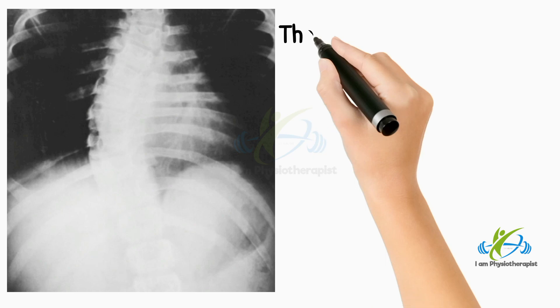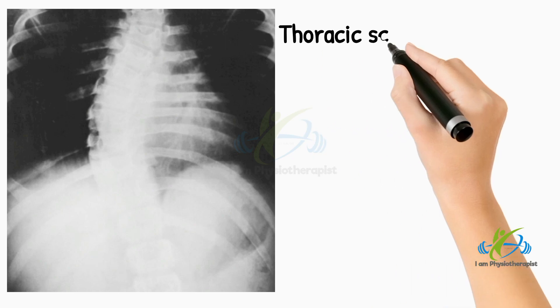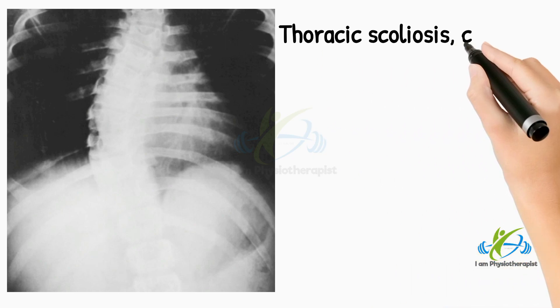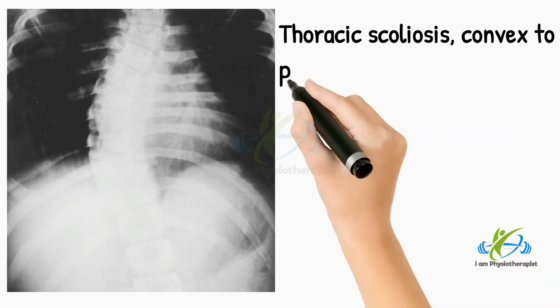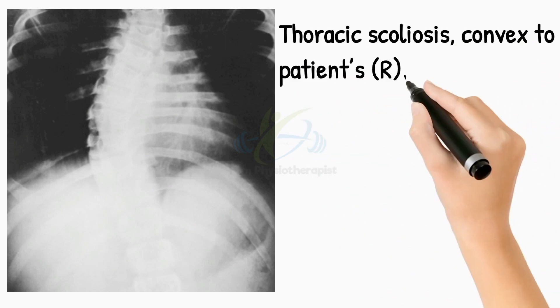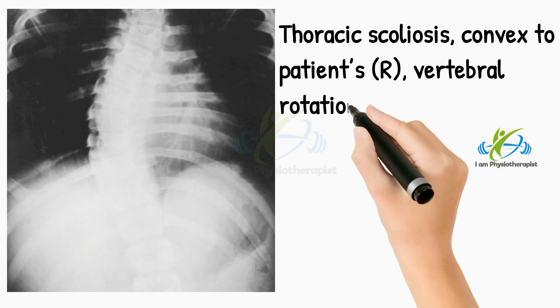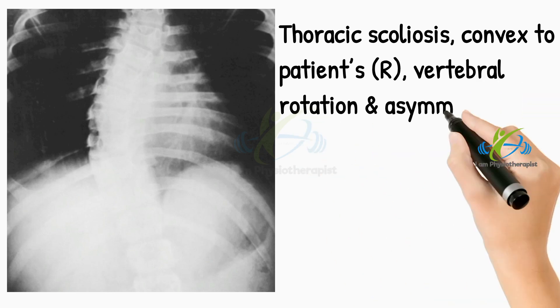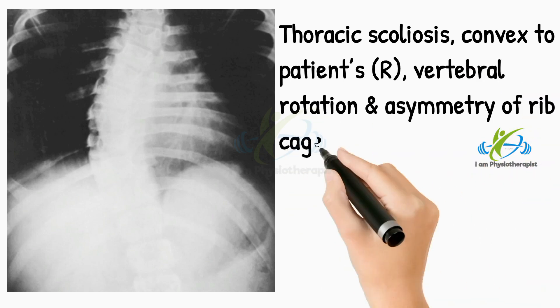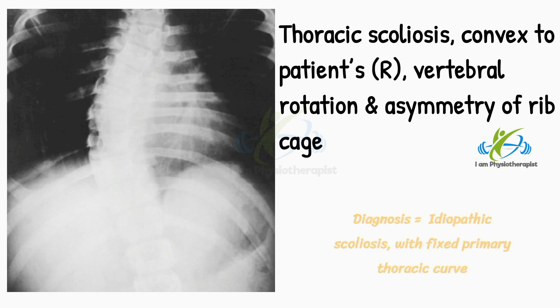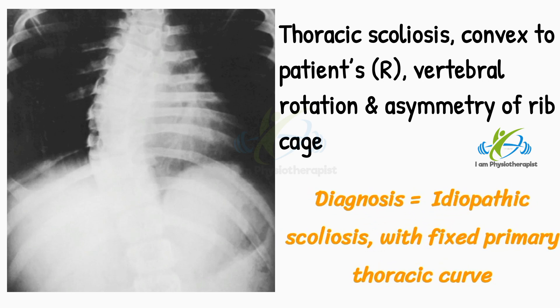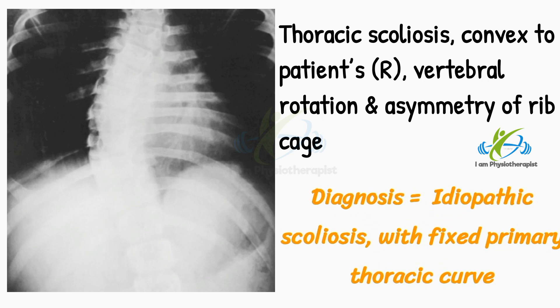This radiograph shows a thoracic scoliosis convex to the patient's right. There is vertebral rotation and asymmetry of the ribcage. Diagnosis is idiopathic scoliosis with fixed primary thoracic curve.